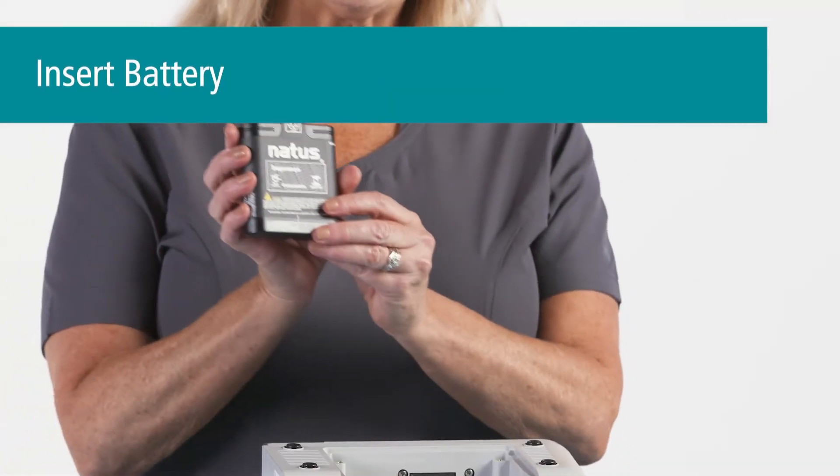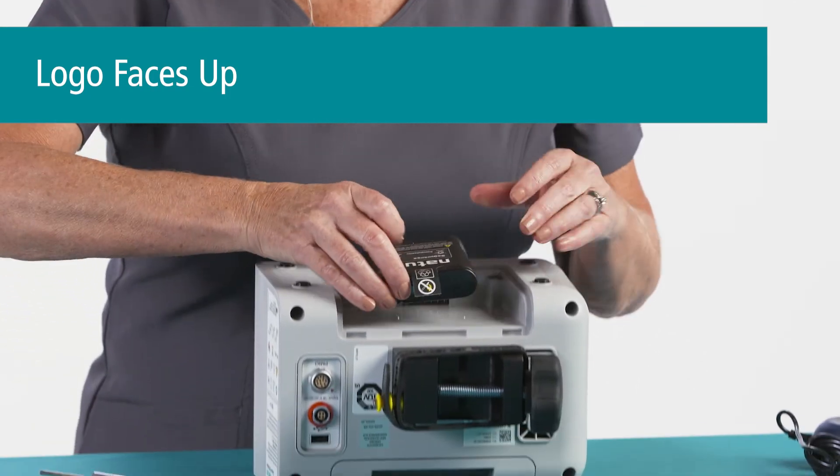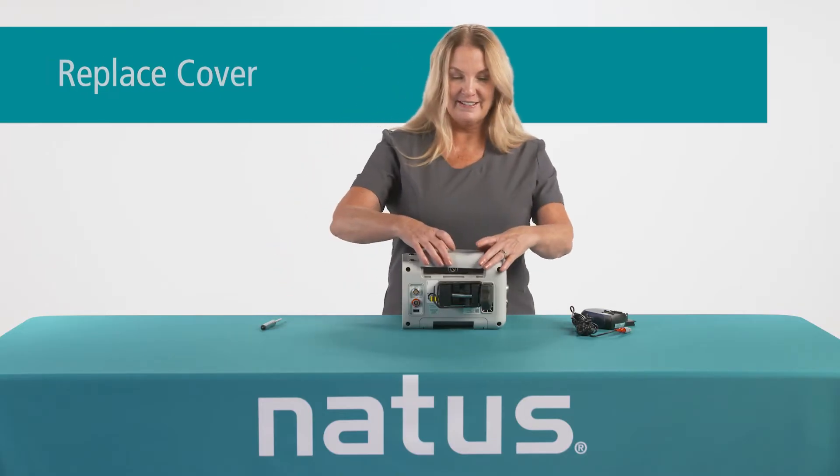To insert the battery, align the pins with the Natus logo facing up. Then replace the cover and tighten the screws.